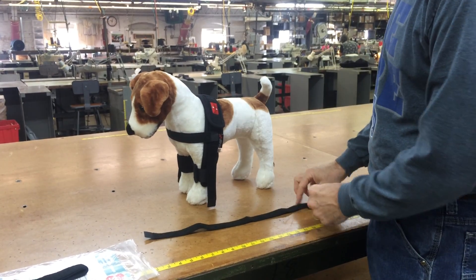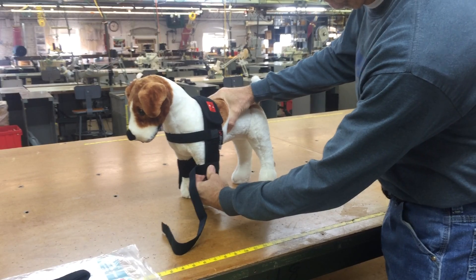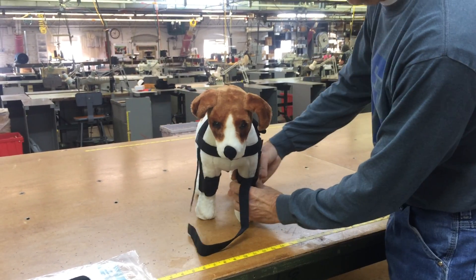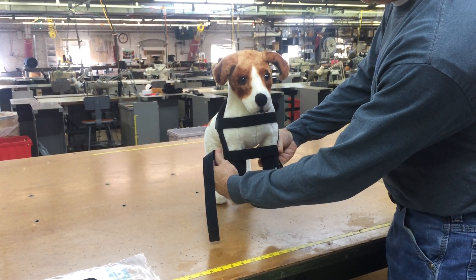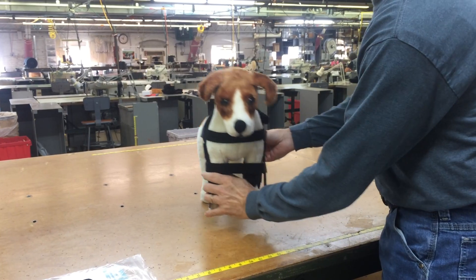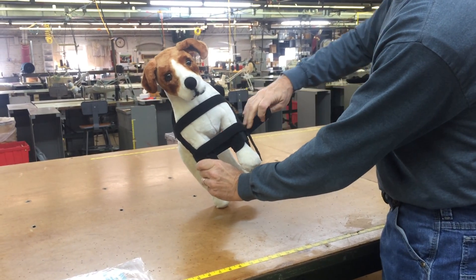Next, attach one end of the hobble strap to the left hobble tab and bring the hobble strap around the front of the dog. Cross over the hobble tab on the right side of the dog. Continue guiding the hobble strap around the back of the dog's legs and back around to the front, circling the legs.